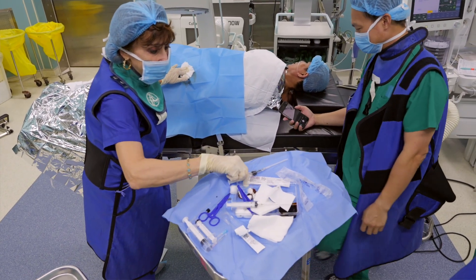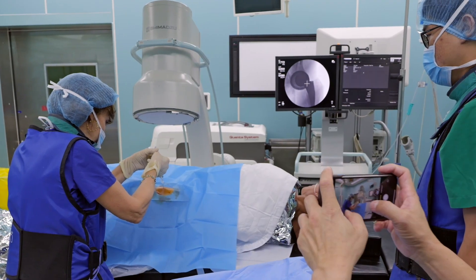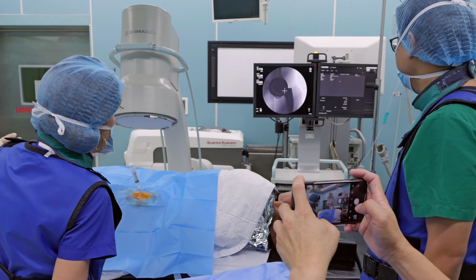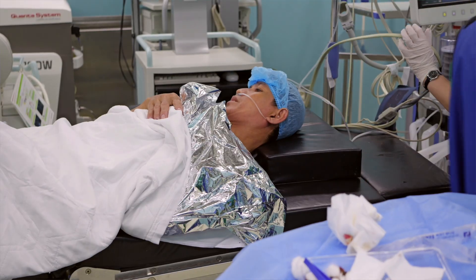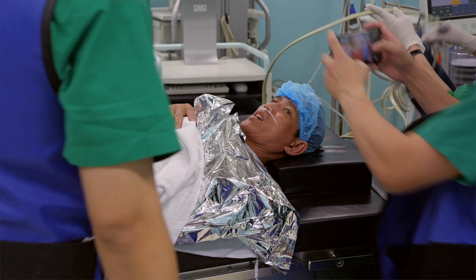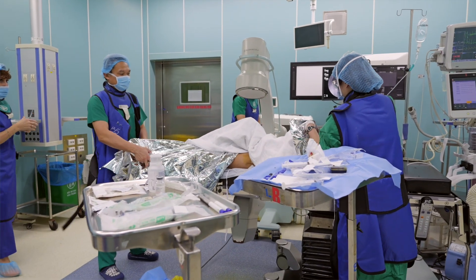We use what's called an anterolateral approach with the patient lying on their side, using an x-ray machine to show the three-dimensionality of the hip joint space. They were happy to see it done and we were happy to teach it — it's faster, it's easier, and it's safer for the doctors and easier for the patients. It's a very safe procedure when done this way.